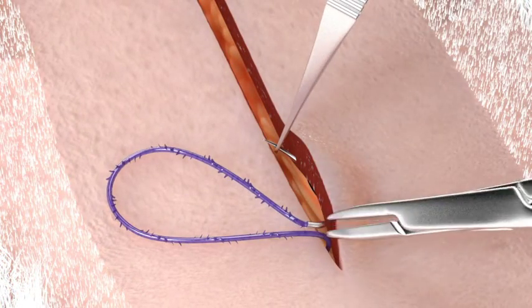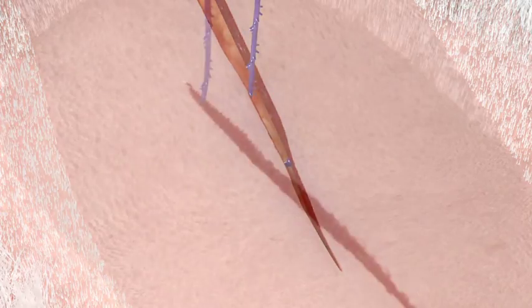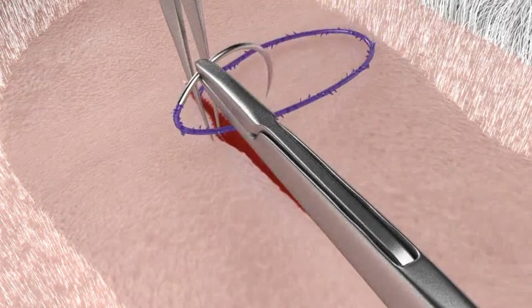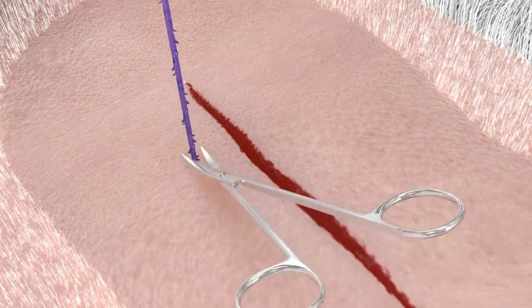Finish the superficial layer closure with the quill device. Once the apex of the wound is reached, exit lateral to the wound again and cut the remaining quill device flush with the skin.